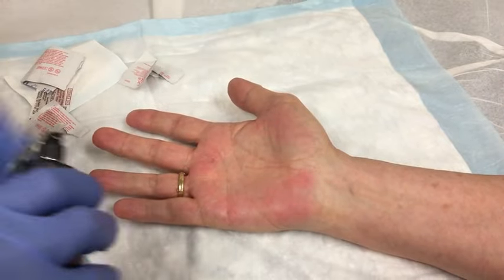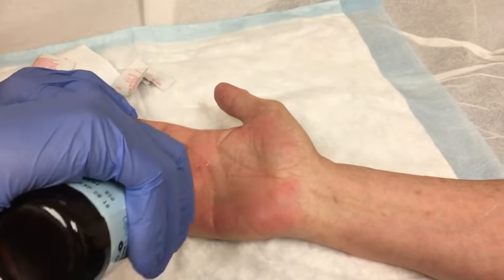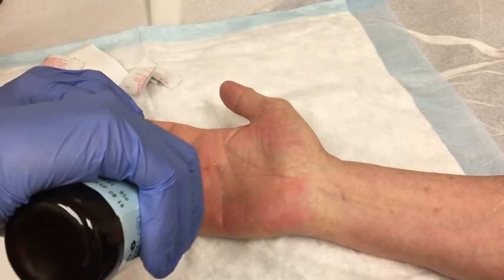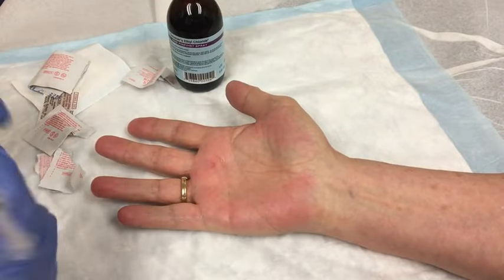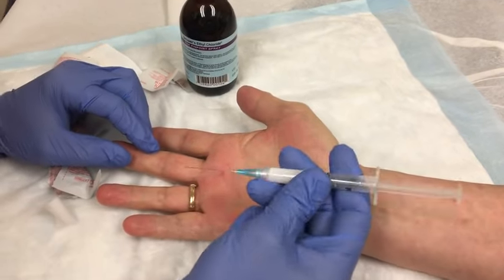So then I'll go in and spray with a little bit of ethyl chloride to dull the pinch of the needle. We're going to have a little pinch, a little pain — just bear with me. Try not to move, okay?